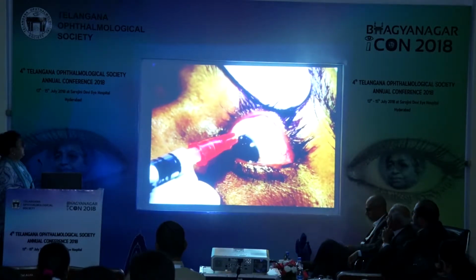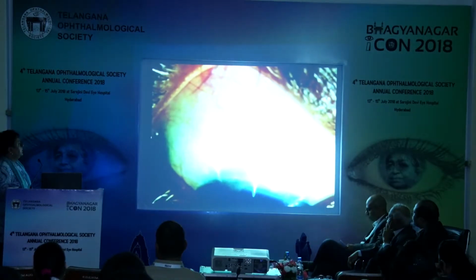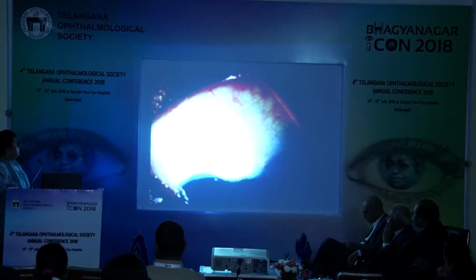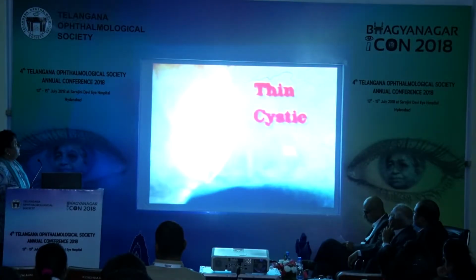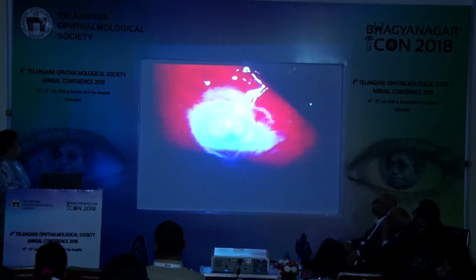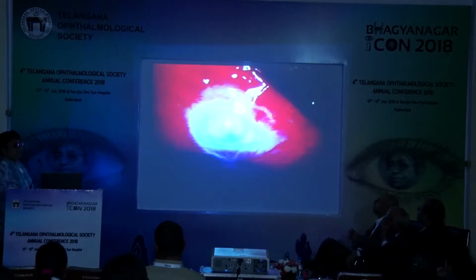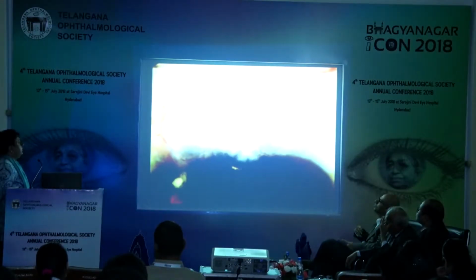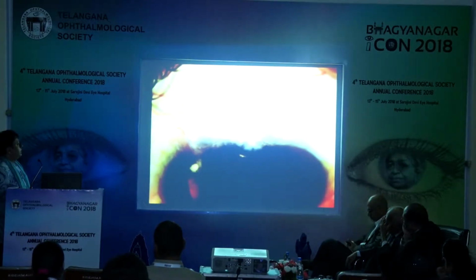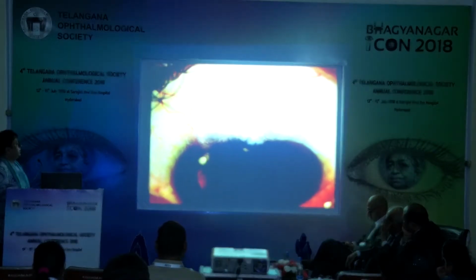It helps to produce a diffuse, low, posteriorly directed bleb, avoiding anterior, thin-walled, cystic, high blebs which are prone to late leaks and blebitis, as well as bleb-associated endophthalmitis. Also, such blebs are symptomatic and can cause Dellen and dysesthesia.